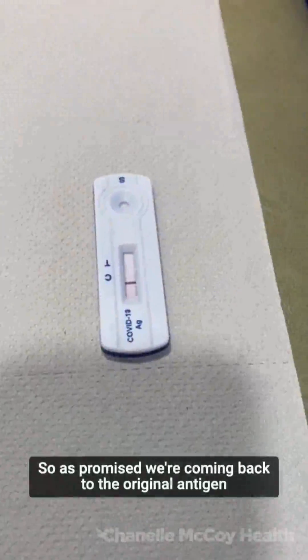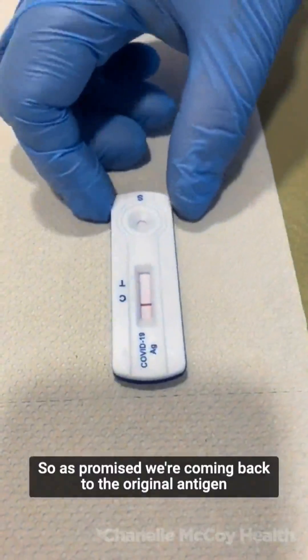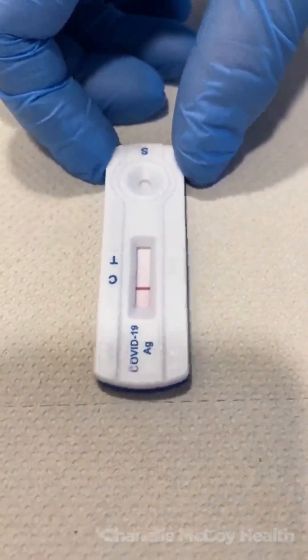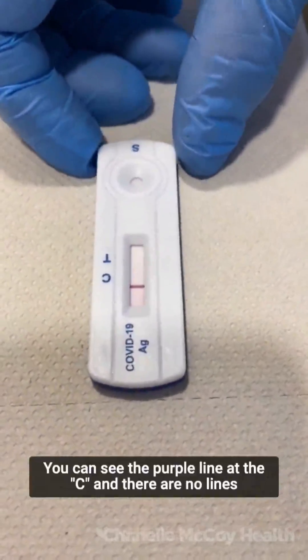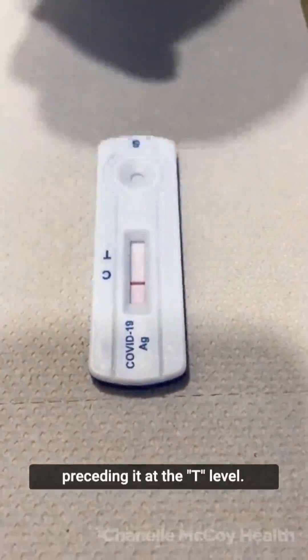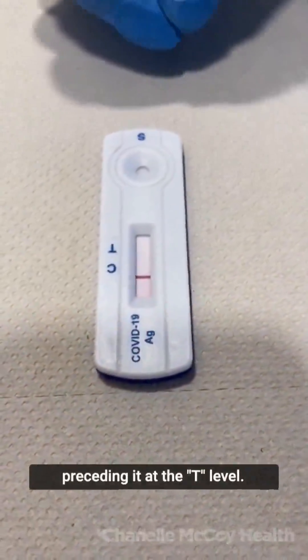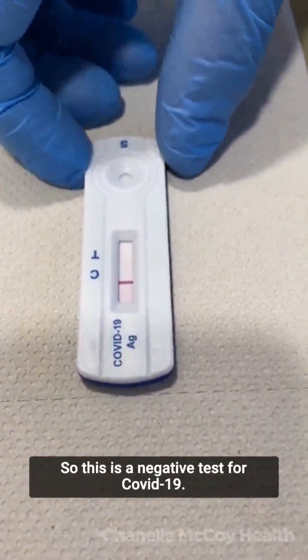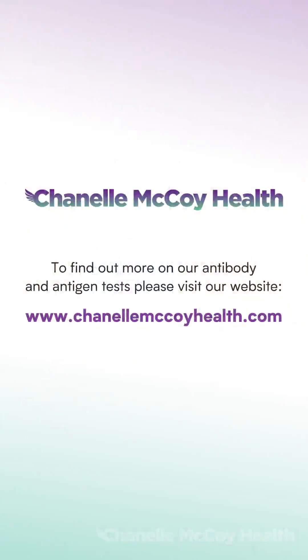As promised, we're coming back to the original antigen test. You can see that clearly this test is valid — there is a purple line at the C, and no lines preceding it at the T level. This is a negative test for COVID-19. Thank you.